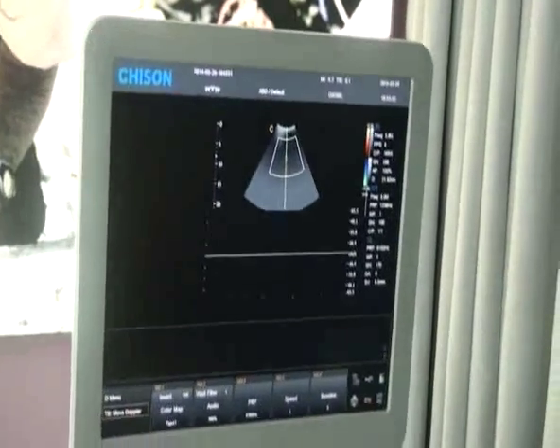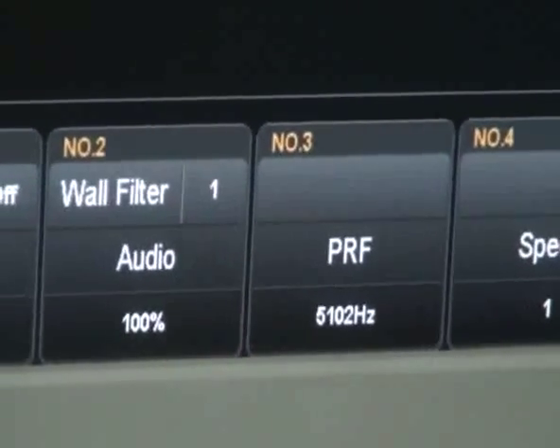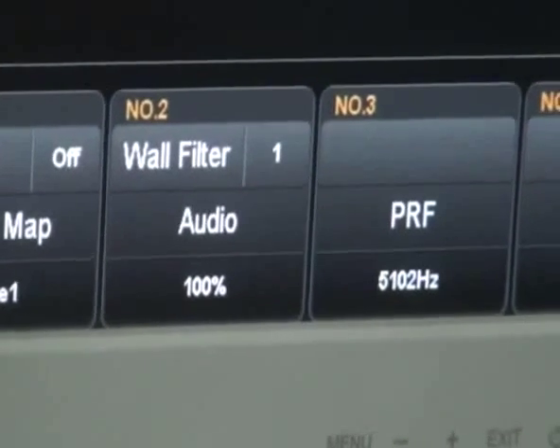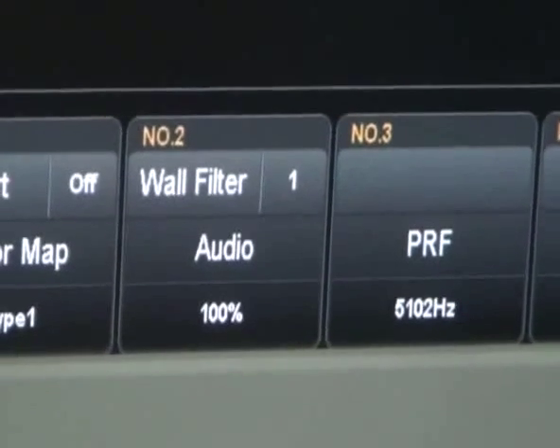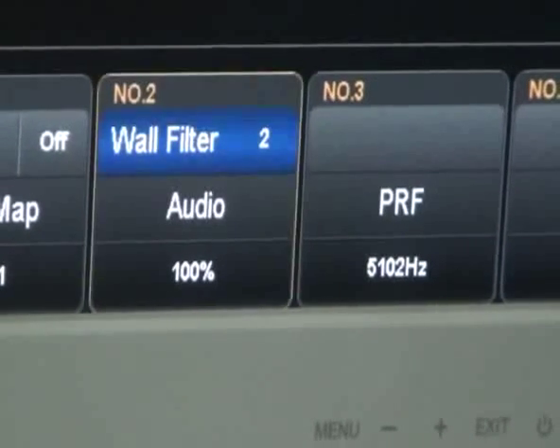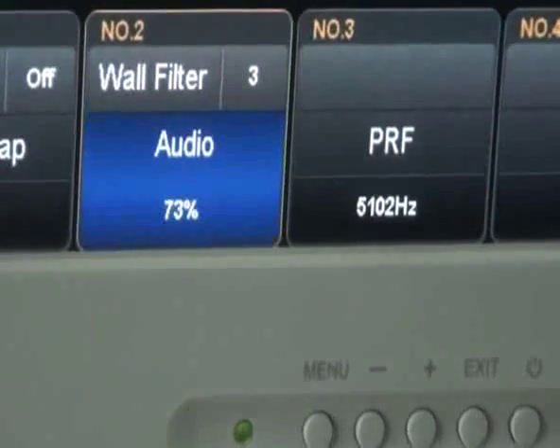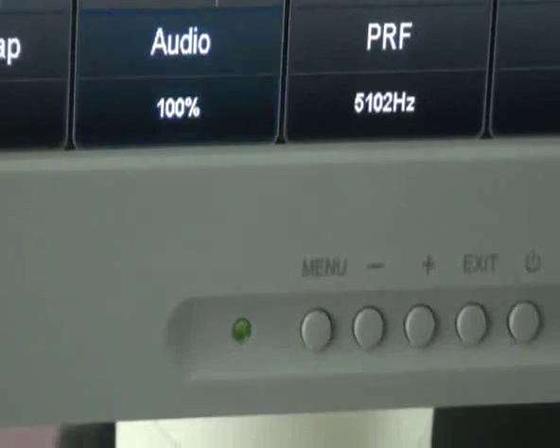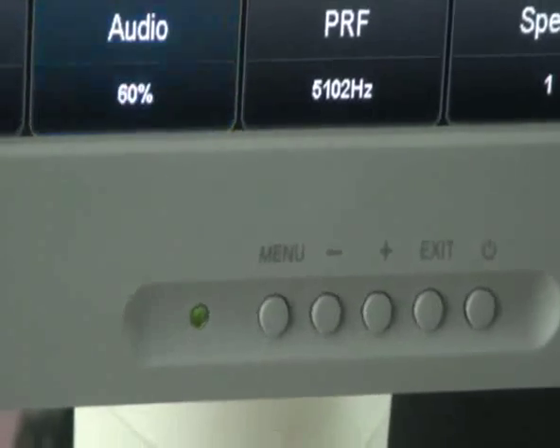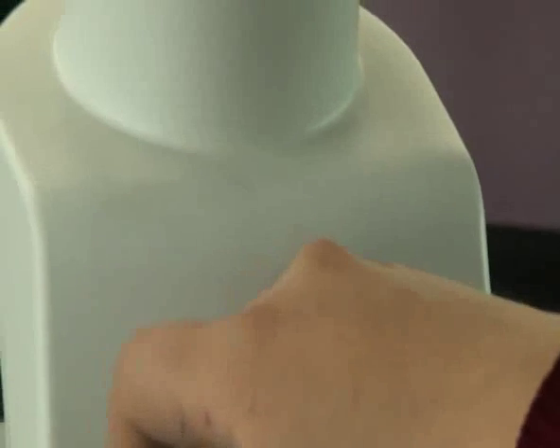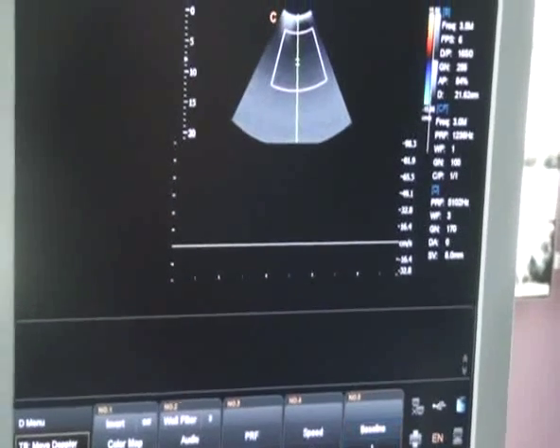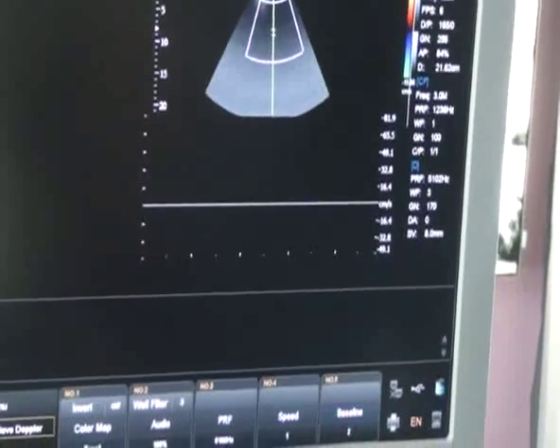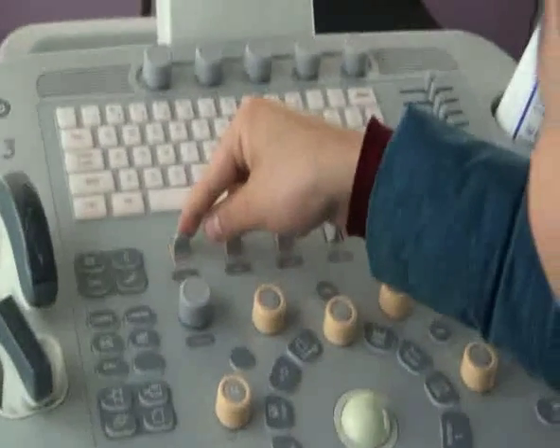In D mode, the most important parameter is wall filter, which is similar to the wall filter in C mode — it reduces noise caused by wall motion. For audio, rotate the knob to adjust the volume of the speaker. Rotate this knob to change the position of the baseline according to the spectrum.